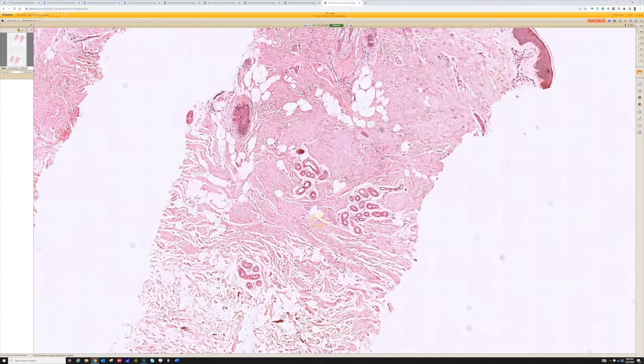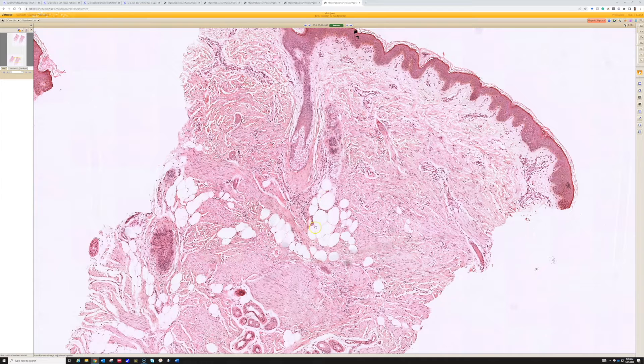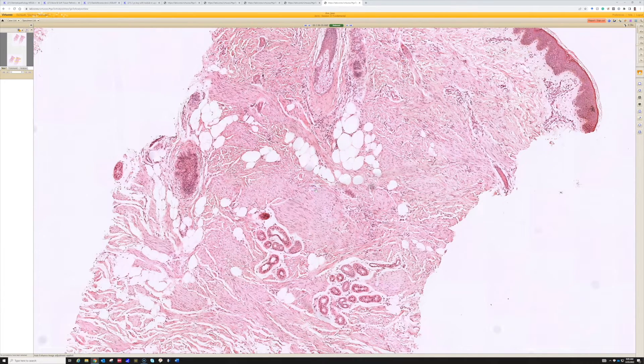So dermatomyofibroma is benign. And the one other entity that could come up here, especially when you see fat entrapped in the middle of it, there's another entity that looks quite similar, in my opinion, and it's called CD34 positive fibroblastic connective tissue nevus. And even though the word says nevus, it's nevus in the sense of like birthmark, the old Latin meaning of nevus, not melanocytic nevus.